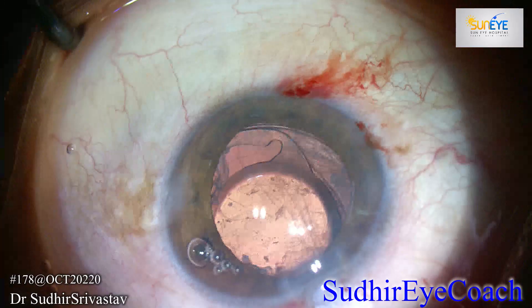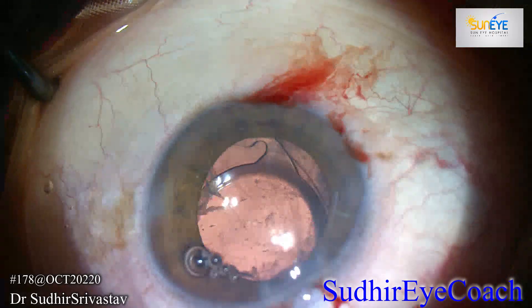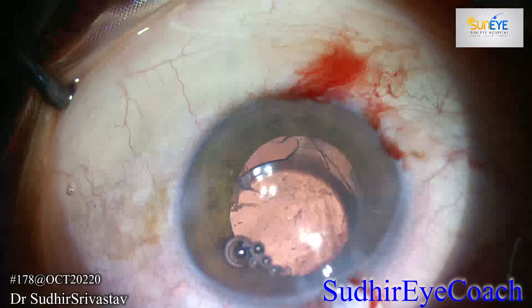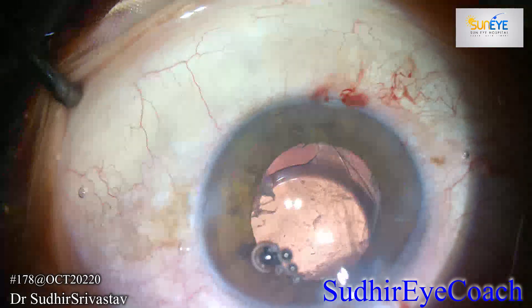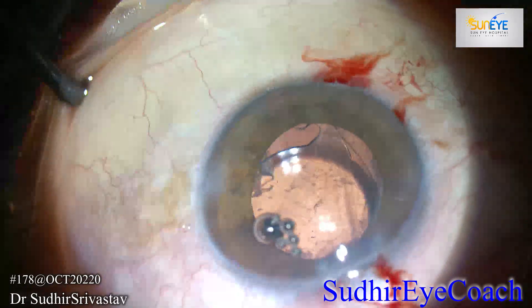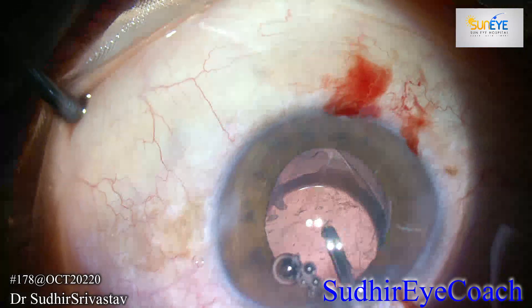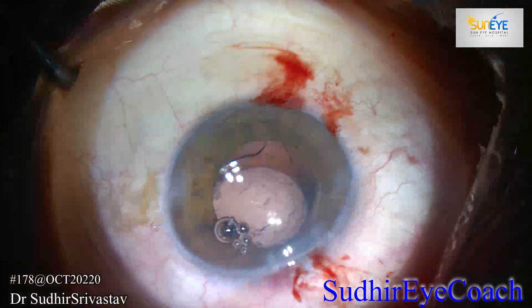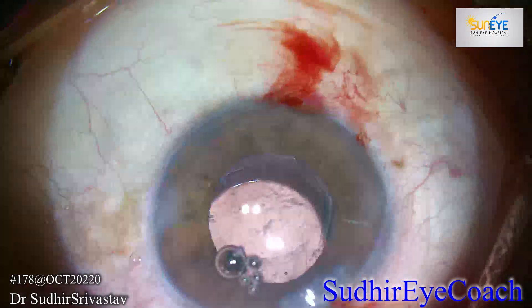When I started cortical cleanup, I caught a tag of vitreous which I was expecting, but the endocapsular ring still in the bag had stretched the capsule well. I decided to remove it so that I could remove any amount of vitreous in the anterior capsule and anterior chamber. These surprises are unavoidable — that is why you have to be prepared for everything and have support in your theatre so that in case of any change in steps or complications, you can manage your surgery well.